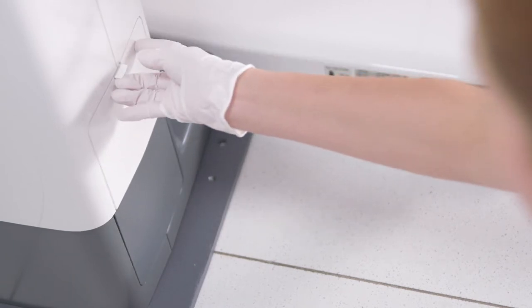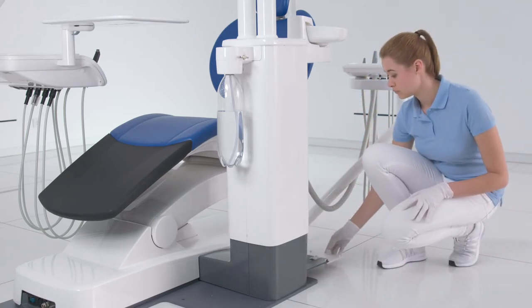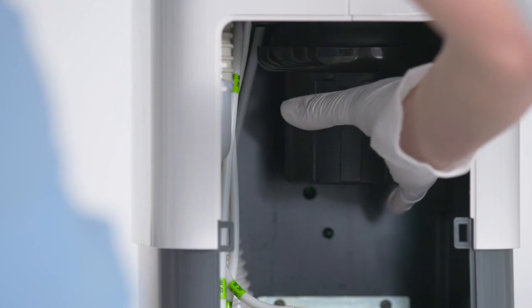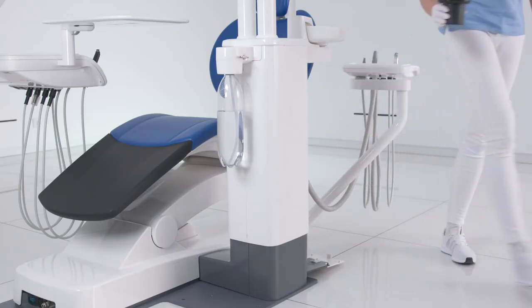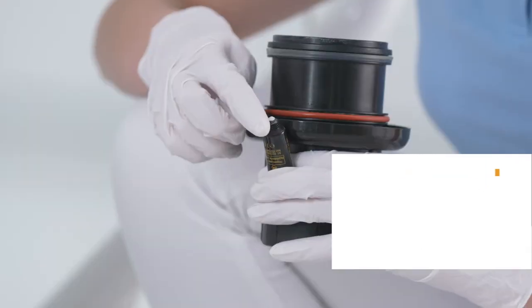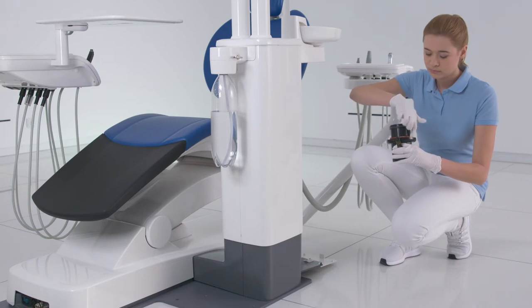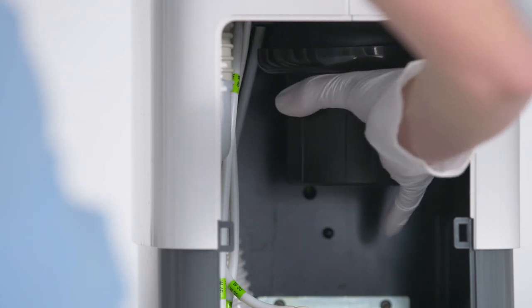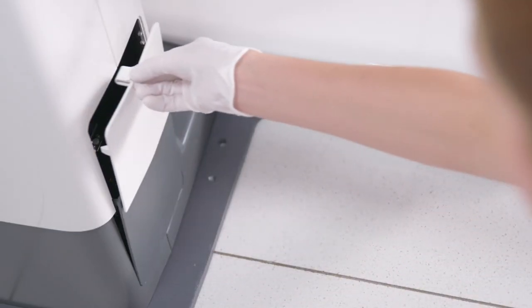Close the flap on the water unit. Open the flap on the base of the water unit to empty the sediment container. In addition to other solid particles, most of the amalgam residues are trapped in the sediment container by gravitational force. Loosen the bayonet catch by turning the sediment container counter-clockwise. Pour the excess water out and collect the amalgam residues. Empty the sediment container at least every four weeks. Grease the O-ring on the sediment container. Hold the sediment container so that the latching tabs of the bayonet catch are positioned transverse to the water unit, then turn it clockwise to screw it in. Close the flap on the water unit.